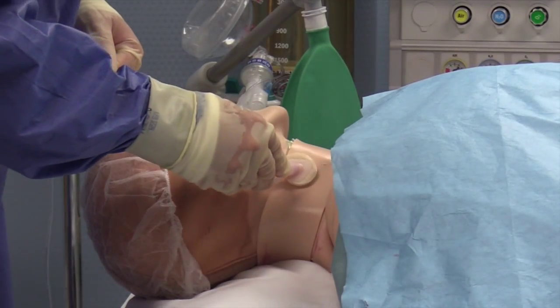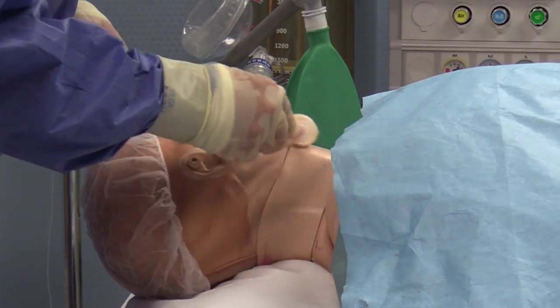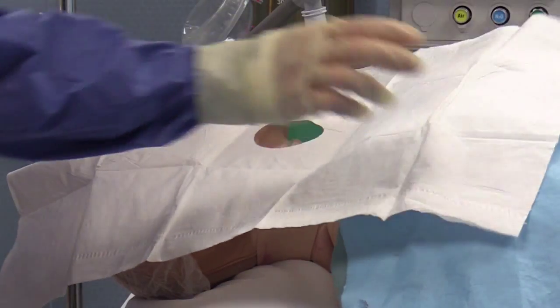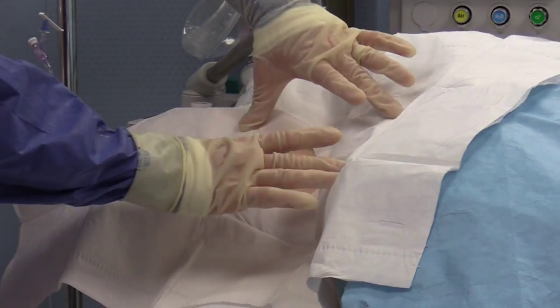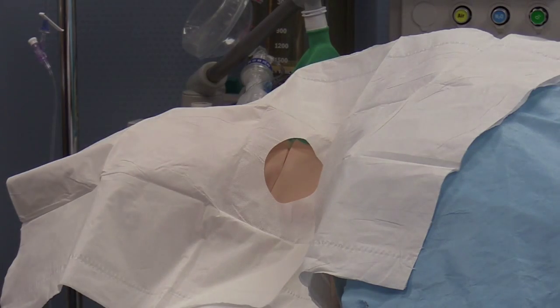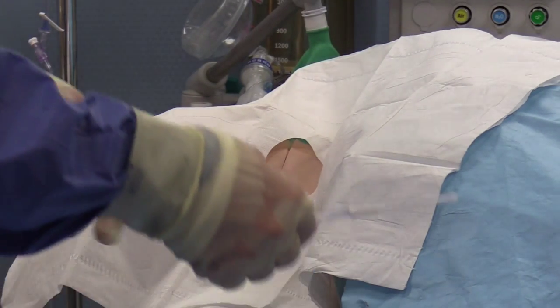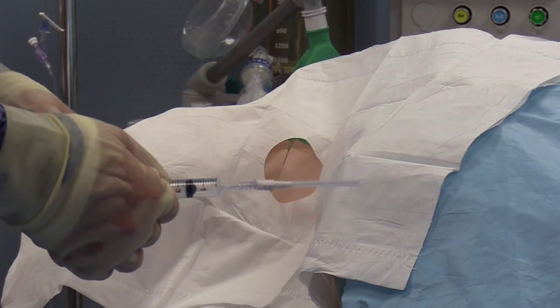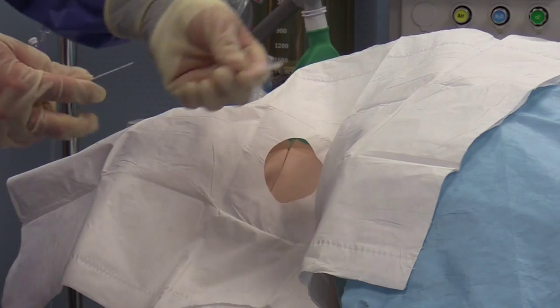You would then prep and drape the patient using a sterile technique. You should again palpate for the carotid pulse and place the hand gently over the carotid pulse and pull gently in the opposite direction from the underlying artery of the intended needle stick.